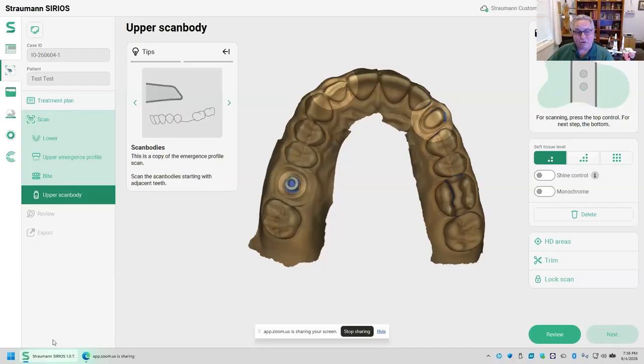My gloves come off. The scanner ships with a laptop that has a touch screen. So we normally recommend that while you're gloved up and scanning, you interact using the touch screen, not the keyboard and touchpad, okay? The reason, of course, is that the touch screen is easy to disinfect later with a simple wipe down, depending on your public health policies in your jurisdiction, either an alcohol wipe or a Cavi wipe. It's easy to disinfect a screen, more difficult to disinfect a keyboard and a touchpad. So we recommend leaving that until this point when your gloves have come off, and now you can come to the computer with clean hands and click on the review step.